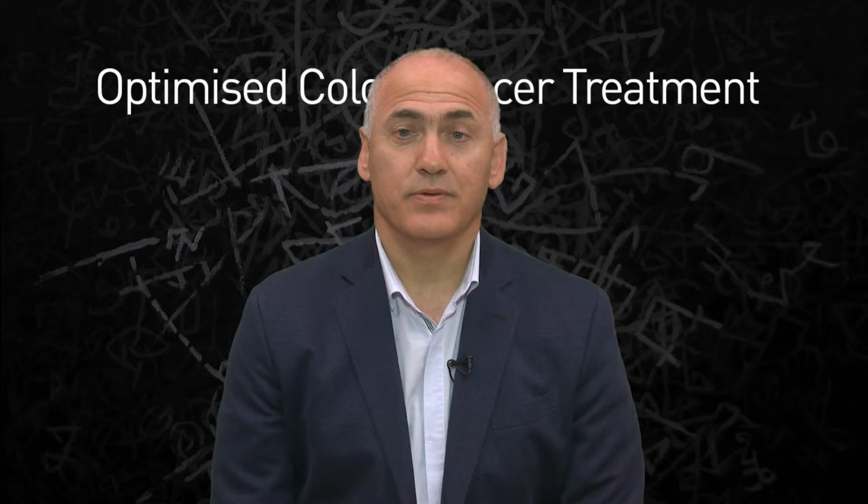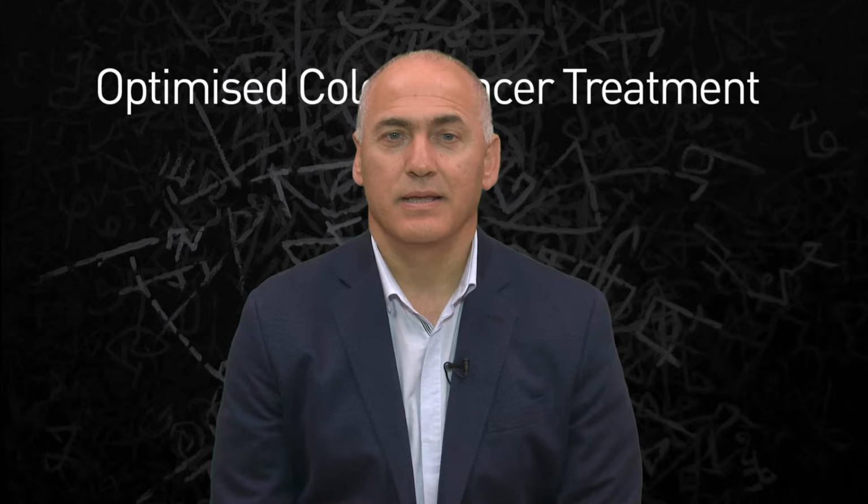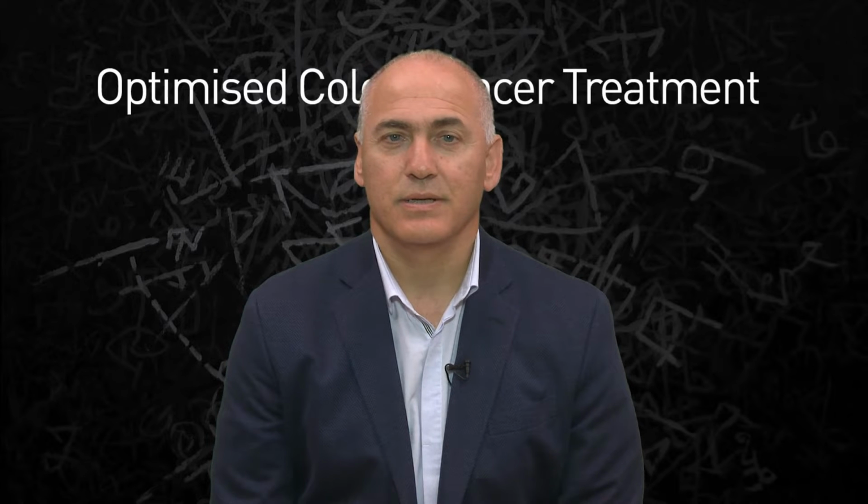As mentioned in the previous section, the extent of surgical procedures was determined by the localization of the cancer and the pattern of potential lymphatic spread. Here, minimally invasive complete mesocolic excision for colon cancer is demonstrated on the following animations.